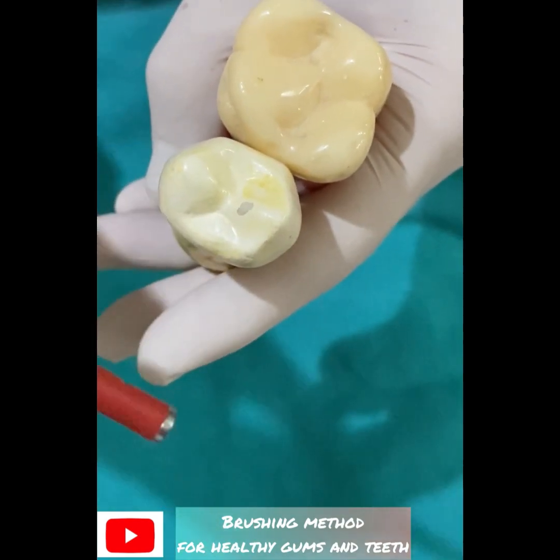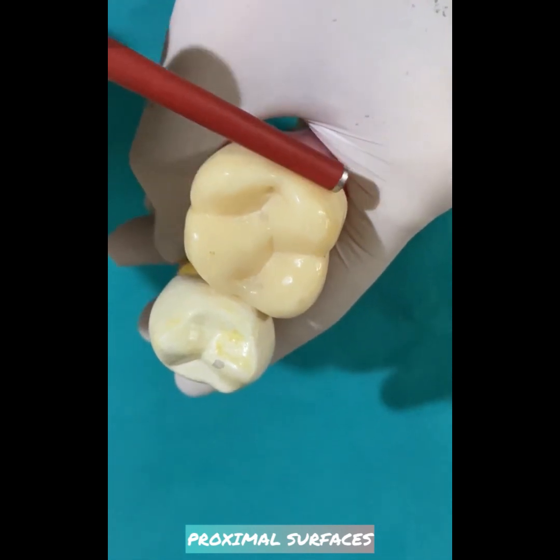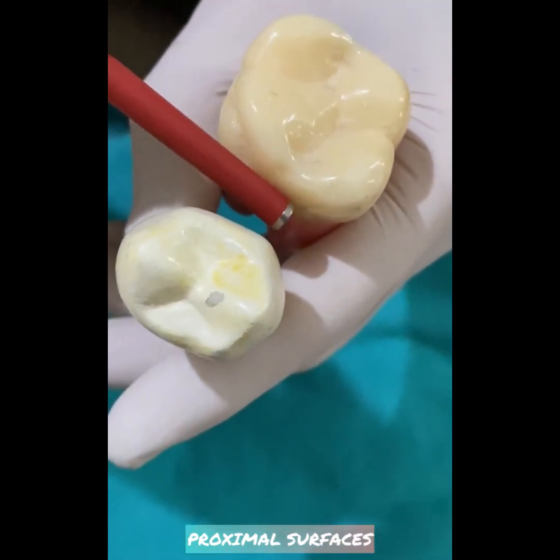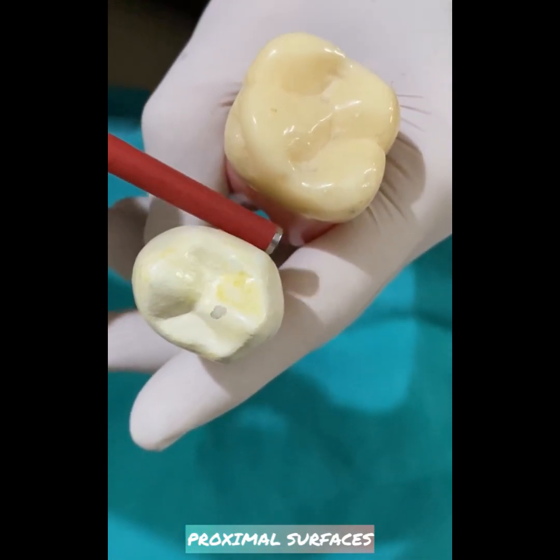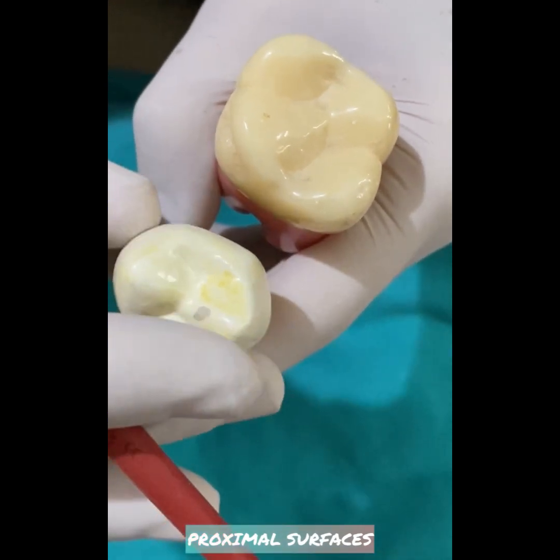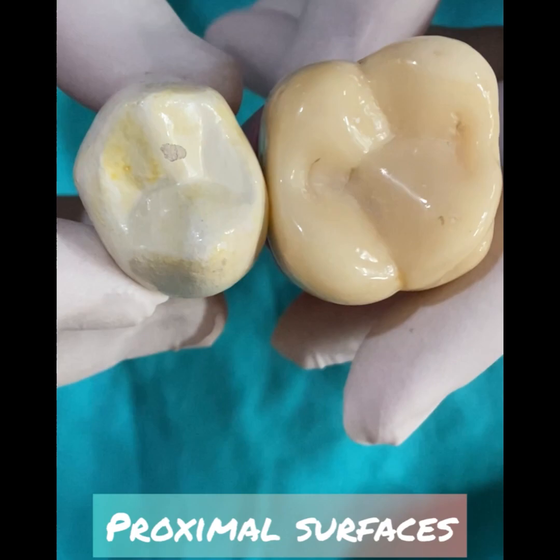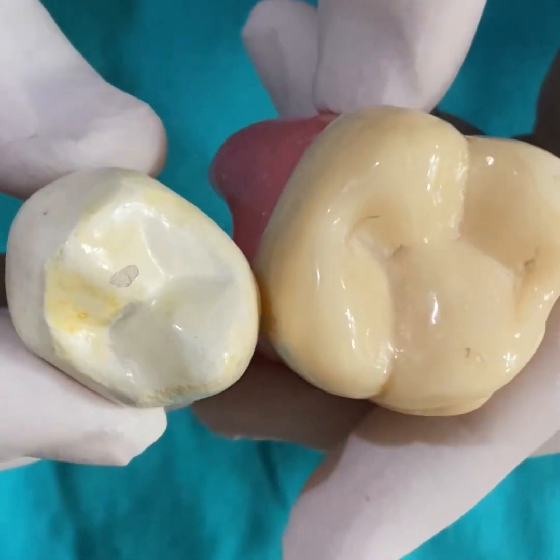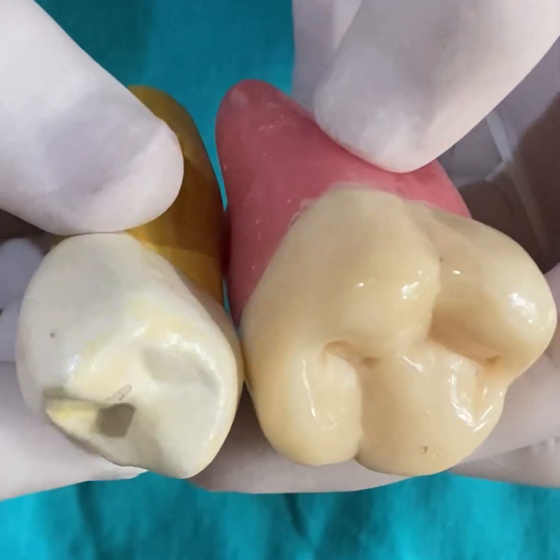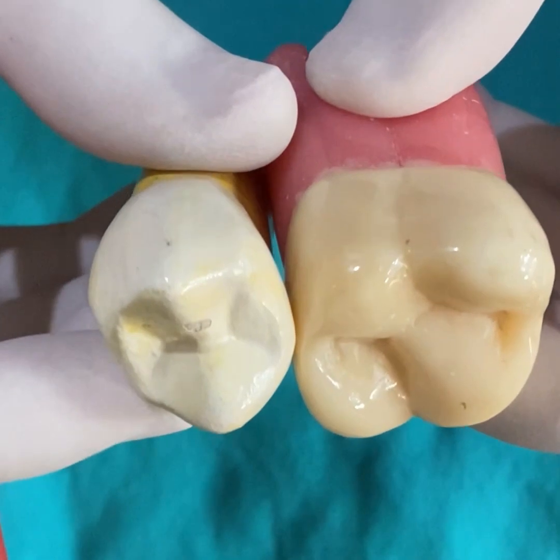But a tooth also has two more surfaces. That is the distal of this tooth and the mesial of the same tooth. Similarly, this tooth's distal, this tooth's mesial. These two surfaces are called proximal surfaces. I just rotate to show the proximal surfaces. Look, they are as big as the buccal and the lingual surfaces.